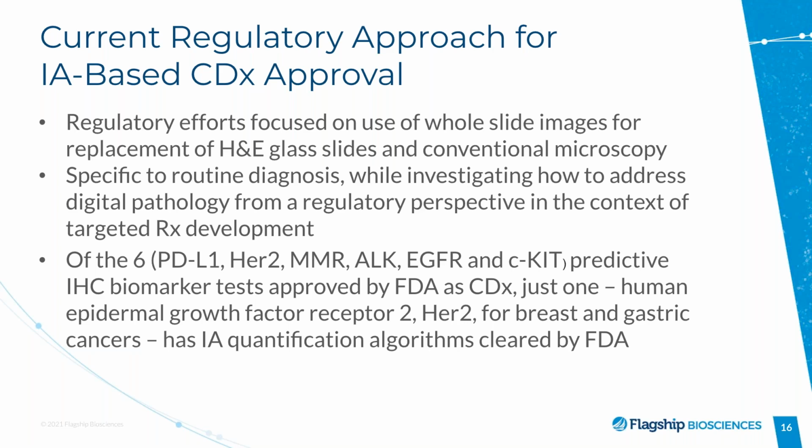And what are the regulations that deal with image analysis? Well, as I mentioned earlier, they are not significantly different from the regulations that apply to every assay. One is to make sure that the analytical sensitivity and the analytical specificity of the digital image analysis are acceptable. And one is to define what acceptable is in the context of the intended use of the assay. Ultimately, one will have to say if the digital assay provides enough accuracy and enough precision to be consistent with a clinical use of this assay.